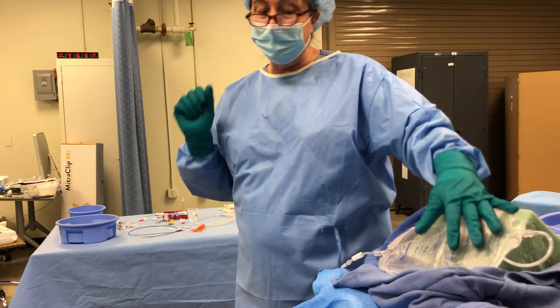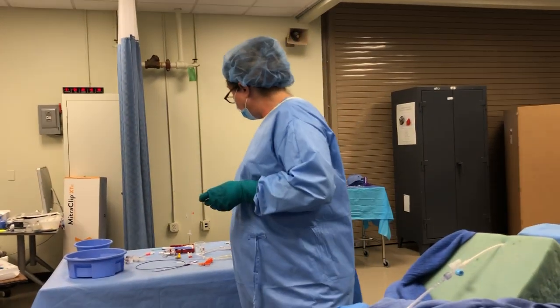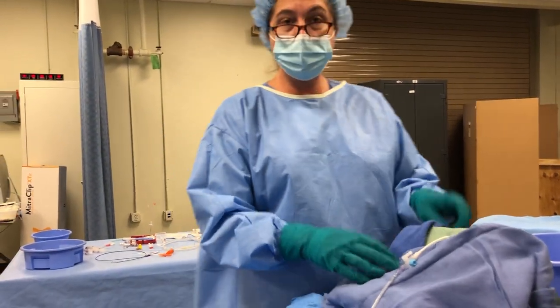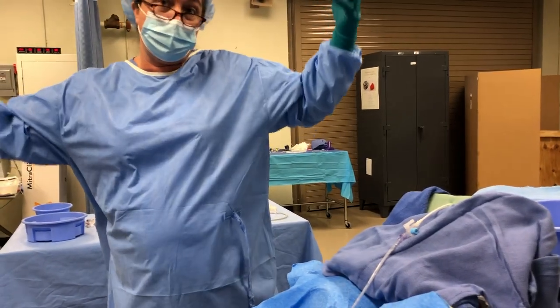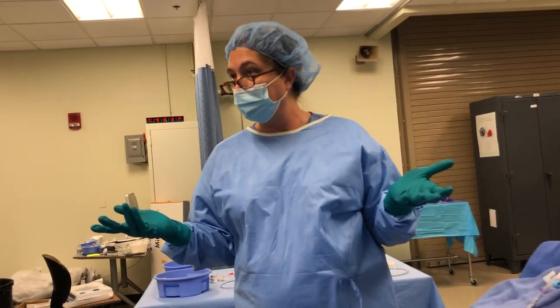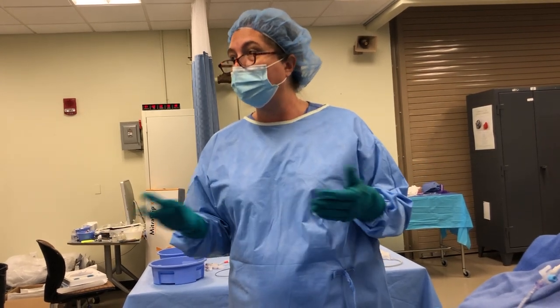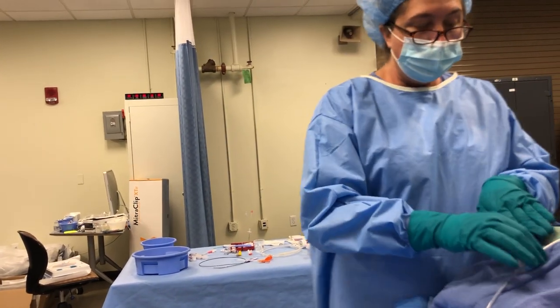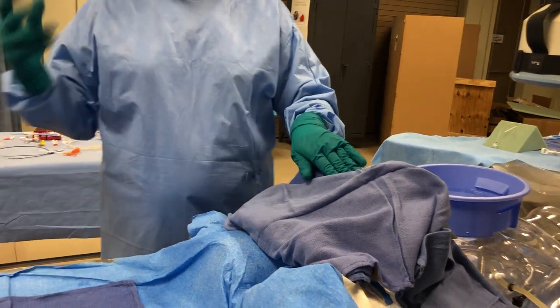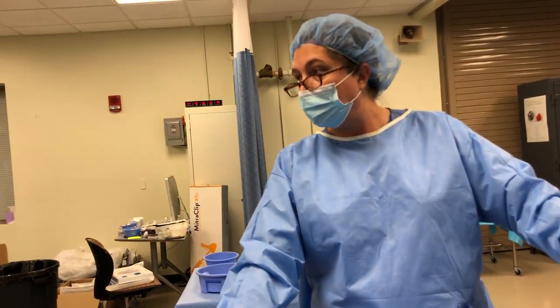If we're at the end of the procedure and we put a covered stent in — a graft-covered stent — and sealed the hole, and the doctor feels comfortable with no more effusion, we let them sit for 20 to 30 minutes, get an echo to check them. Then we may just pull it out, apply a little bit of pressure, and put a small bandage on this area — pulling it very similar to a venous sheath, applying light pressure for about 5 minutes. Remember, it is not a high-pressure system, so we don't have to put a lot of pressure on it.